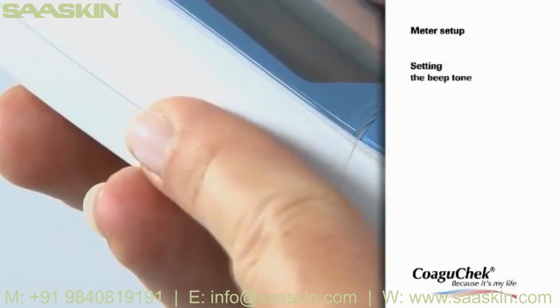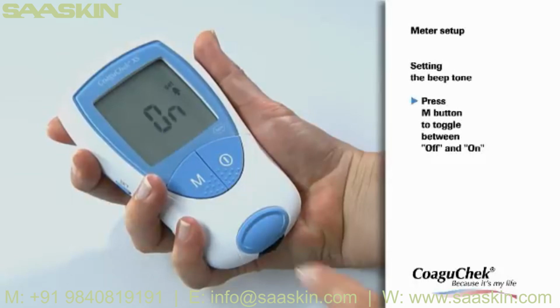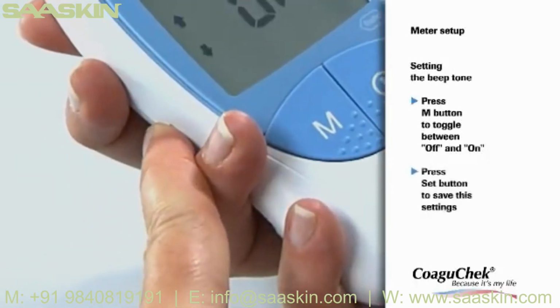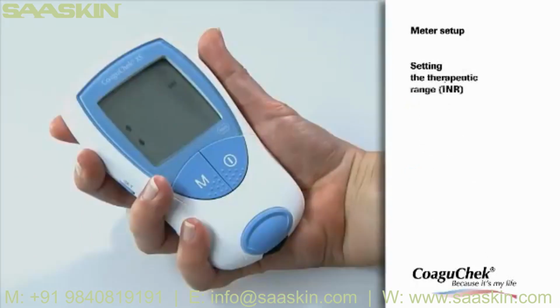Now you can choose whether you want the beep tone on or off. It is recommended to leave the beep tone turned on. Please press the Set button to save your setting. The display automatically moves on to the next setting option.